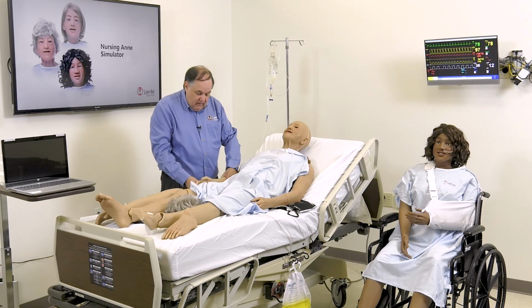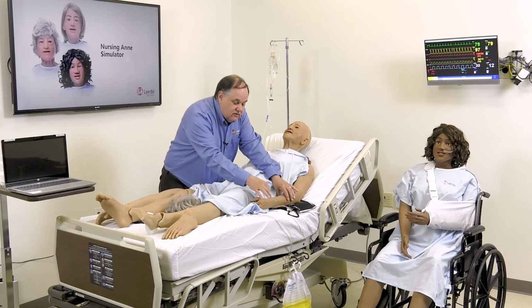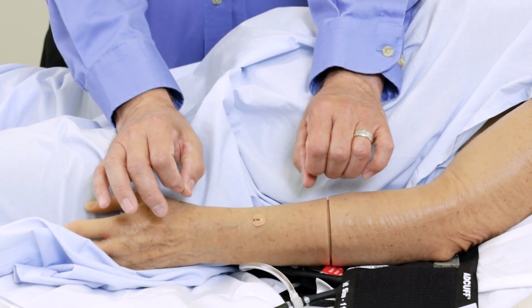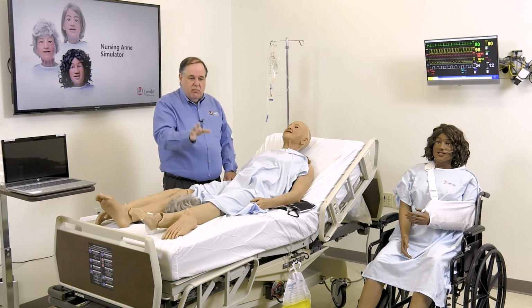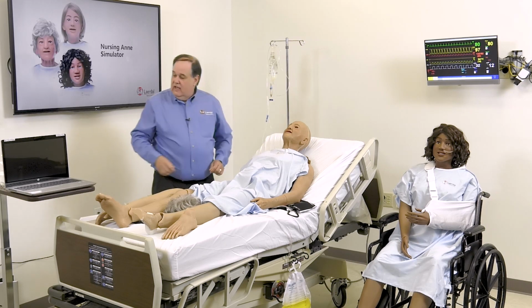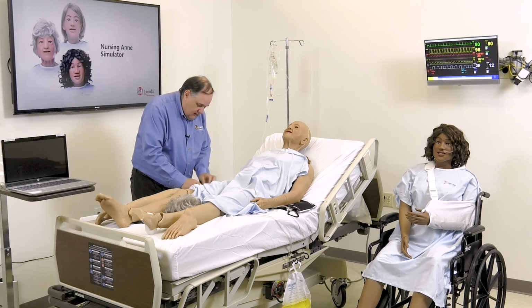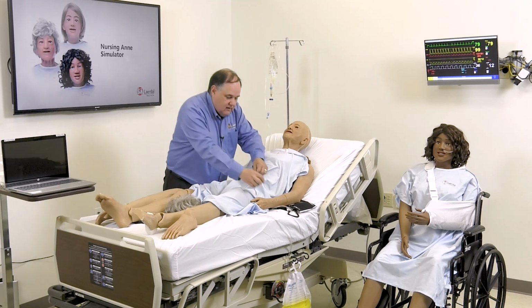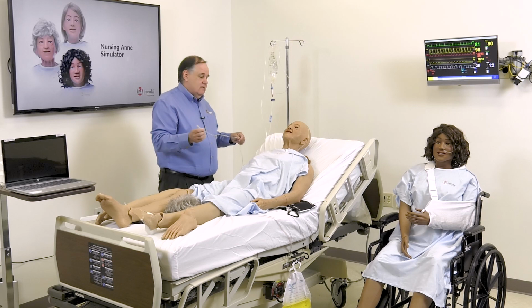We have her here, again, on both sides. It's a bilateral IV site. So I'm sorry I don't have a catheter, but if you can imagine just inserting the catheter like you would normally do, it does not change your approach or your clinical practice in any way. It's exactly what you would normally do to cannulate an IV. It allows you to push off the needle, pull it out, and then actually connect, and again, obviously connect with your IV tubing. And again, we can take our IV tubing and connect it to whatever catheter you had on that side. So again, with the catheter in place, I could connect and then secure my IV as I normally would. Okay, I hope that makes sense.